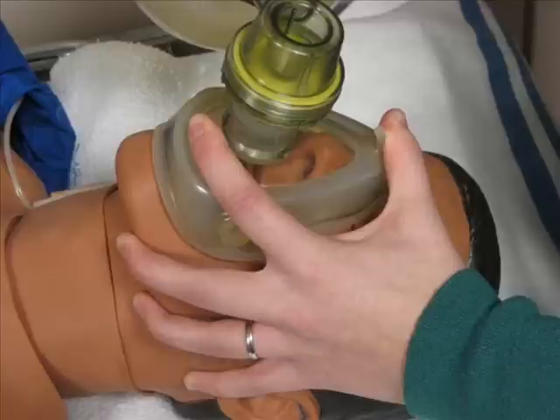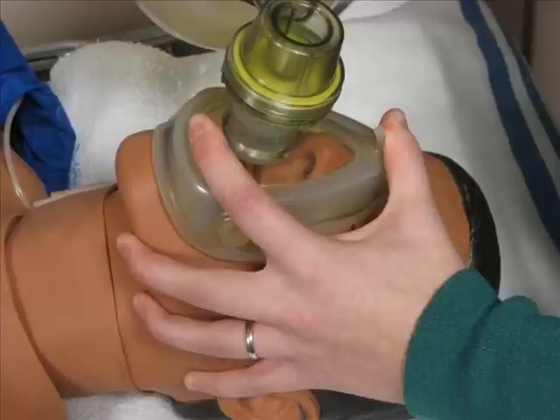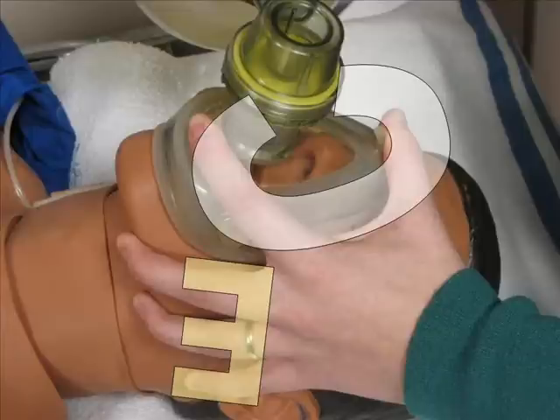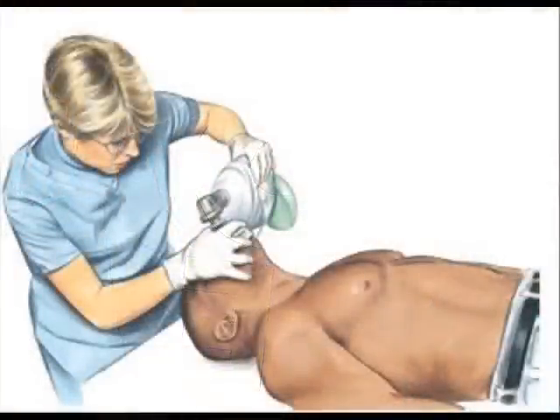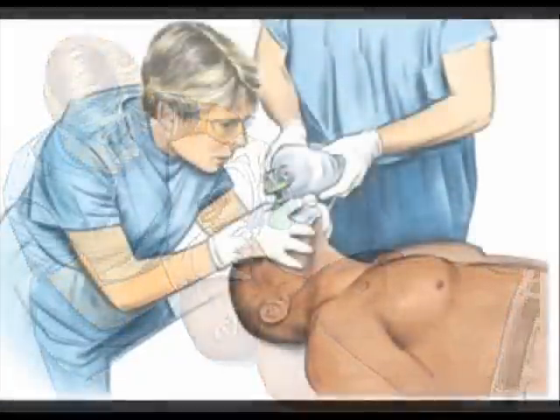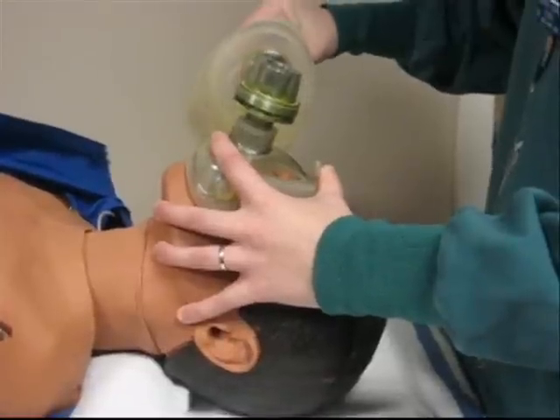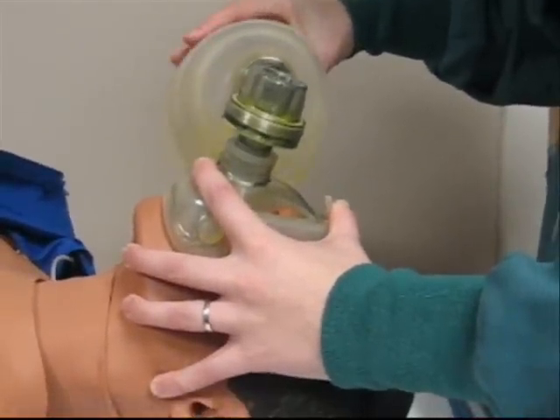Place an appropriate size face mask on the patient, obtaining a tight seal with the mask covering the mouth and the nose. The upper two fingers should form a C, with the lower three fingers forming an E. The C and E positioning should be pulled together such that the rescue breather is properly positioned and maintaining a tight seal. This may also be adapted for two-person ventilation, with the individual holding the mask using both hands. Note the relative positioning of the hands with the three lower fingers forming the E going along the crest of the mandible.